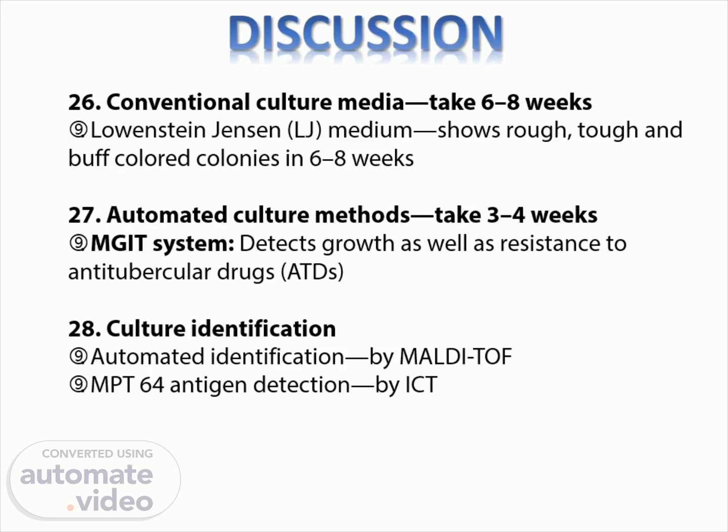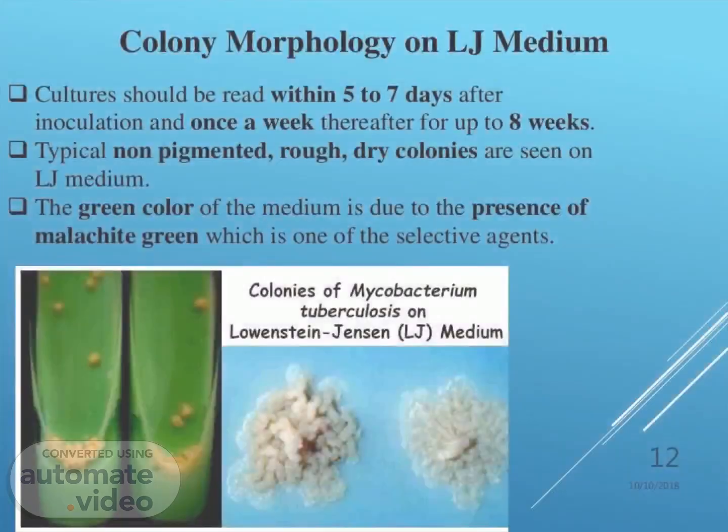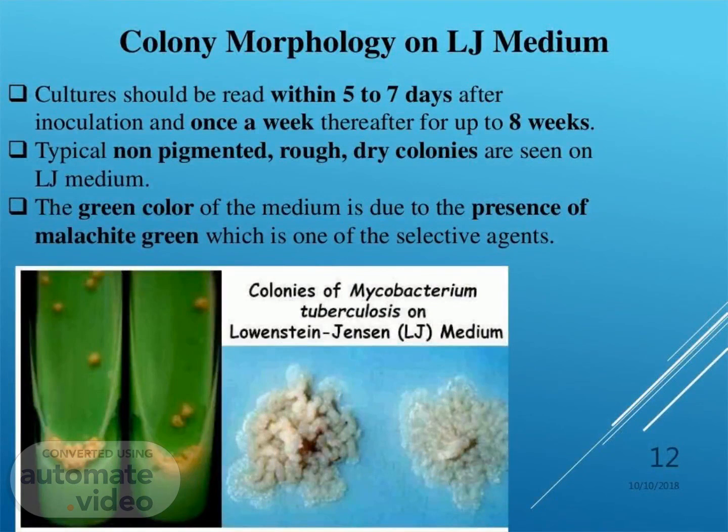Next question. Latest culture identification. Automated identification by MALDI-TOF. MPT64 antigen detection by ICT. Morphology of the colony on LJ medium.